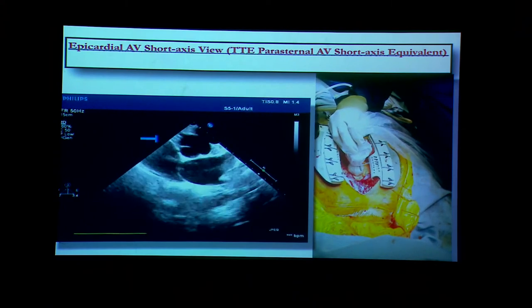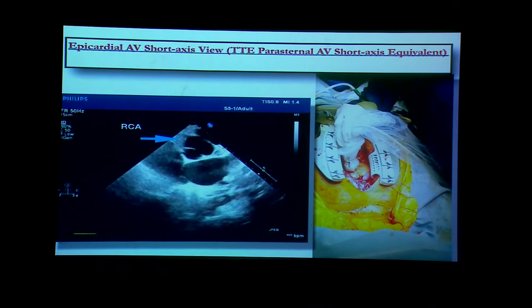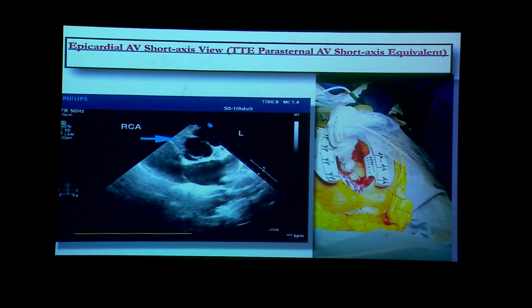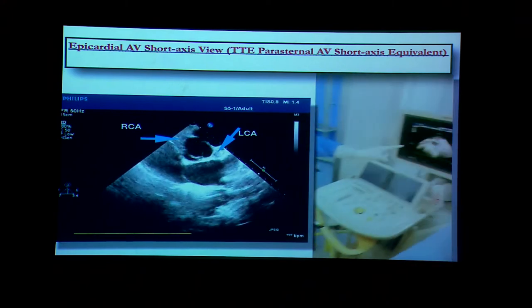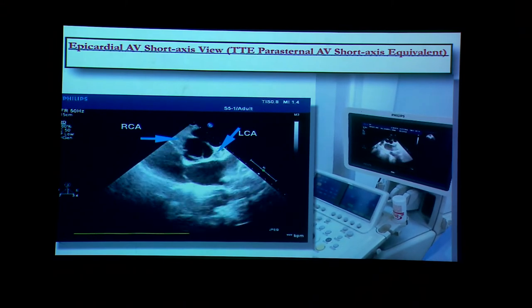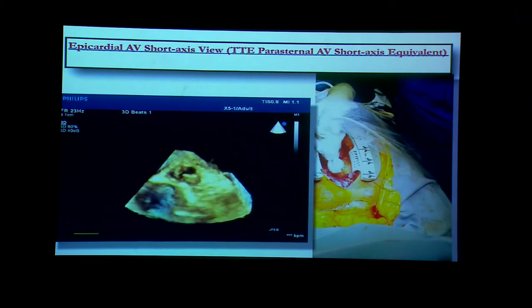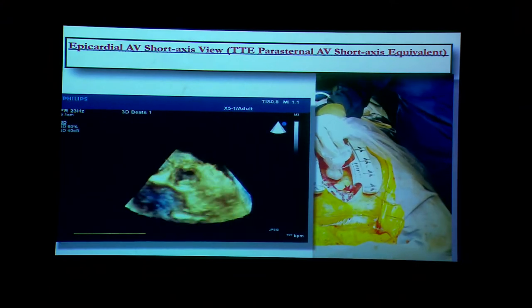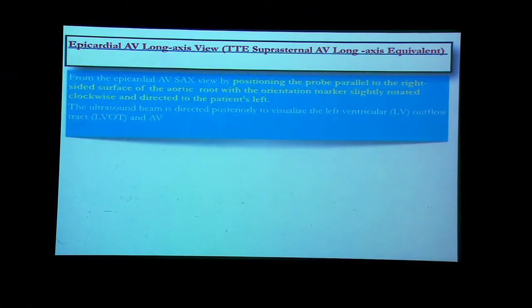By moving the probe slightly forward, we can see anterior structures like the right coronary artery and left coronary artery. These structures can be easily visualized with a minor probe movement. We can even use a transthoracic 3D probe to get very nice structures of the pulmonary valve and the main pulmonary artery. From the aortic valve short axis view, we proceed to the aortic valve long axis view.